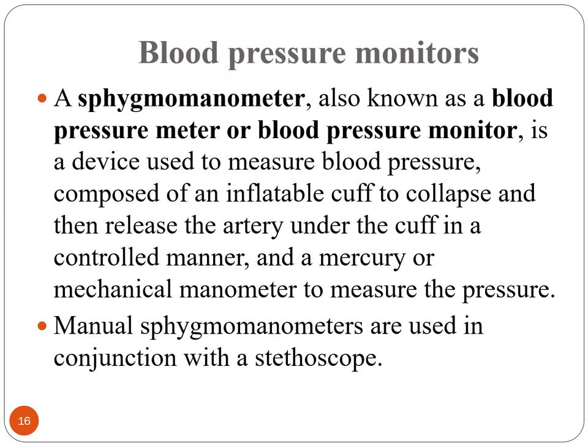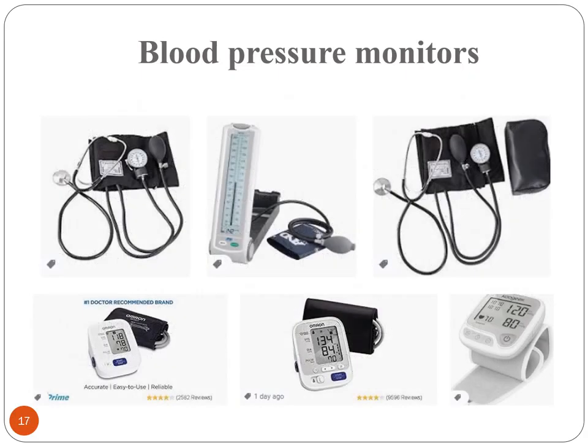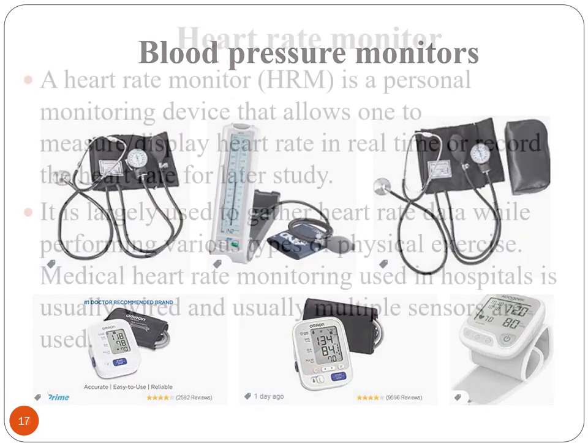Manual sphygmomanometers are used in conjunction with a stethoscope. These are examples of manual blood pressure monitors and digital blood pressure monitors.